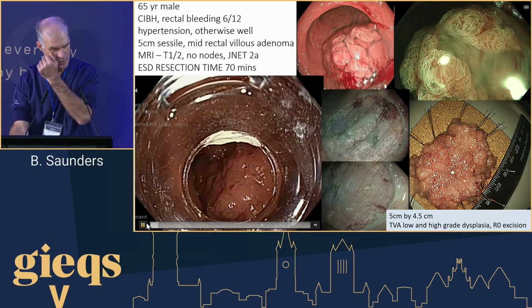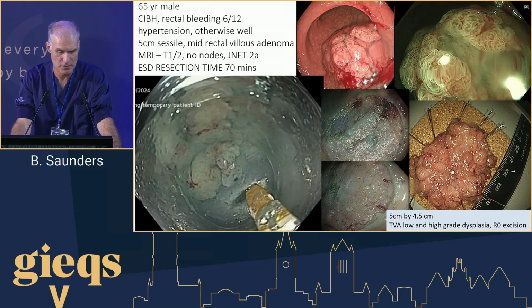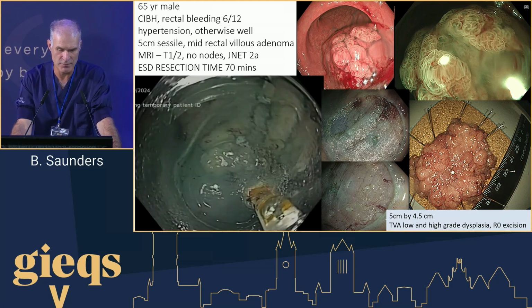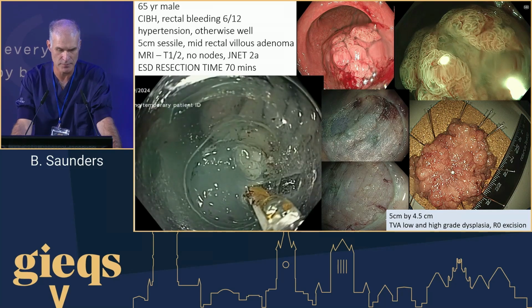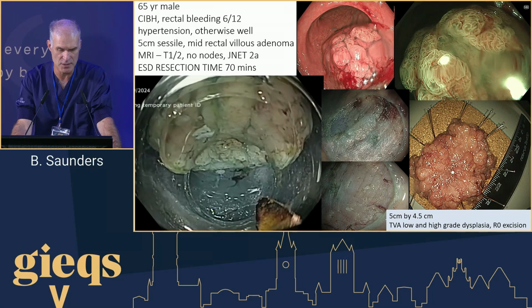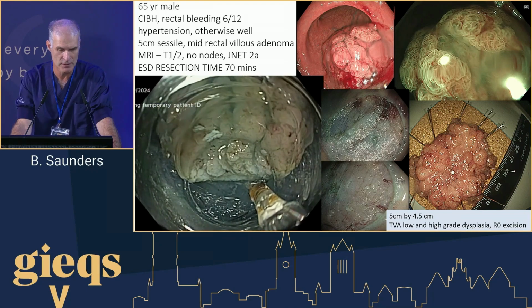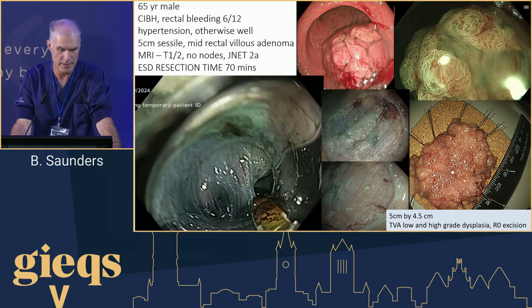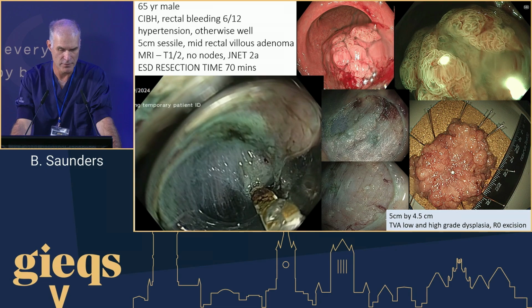This is using the new ultra slim SpeedBoat, which finally is down to a size whereby it's very practical and can be used through a gastroscope or a pediatric colonoscope. And this has novel properties in that we're using radiofrequency cutting and then microwave coagulation. There's microwave coagulation for a small vessel. And then later we've got a larger vessel here, which we can microwave and then cut.